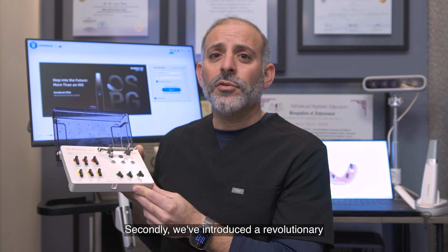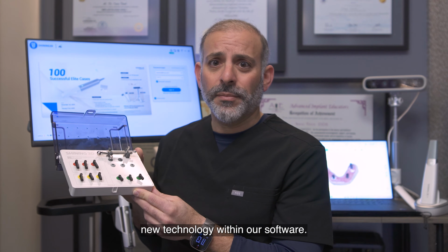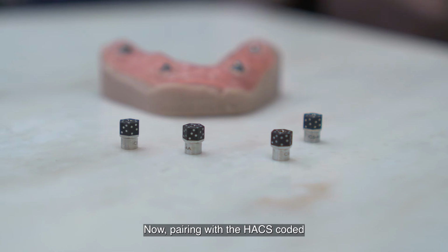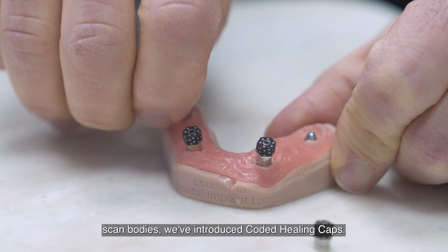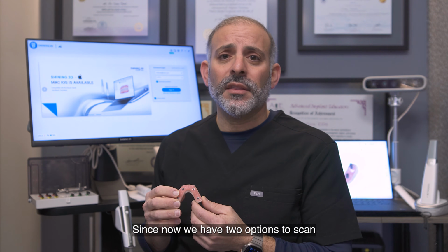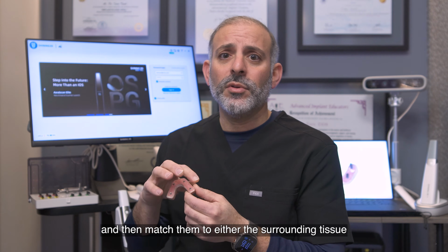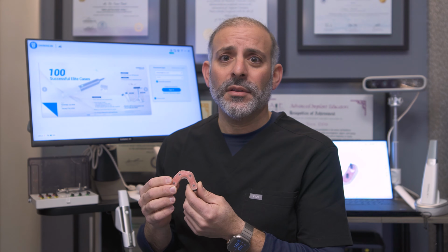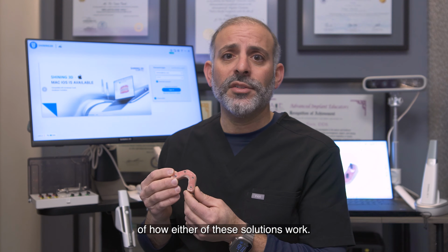Secondly, we've introduced a revolutionary new technology within our software. Now, pairing with the HACS coded scan bodies, we've introduced coded healing caps. Since now we have two options to scan the high accuracy coded scan bodies and then match them to either the surrounding tissue or to the cap scan bodies, we'll take you through a small demonstration of how either of these solutions work.